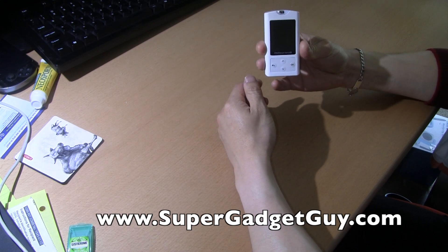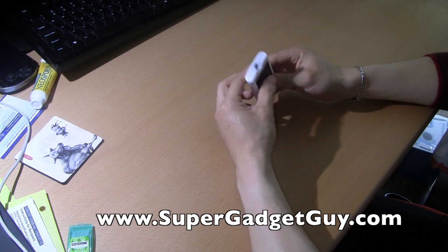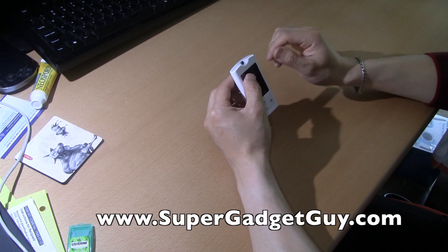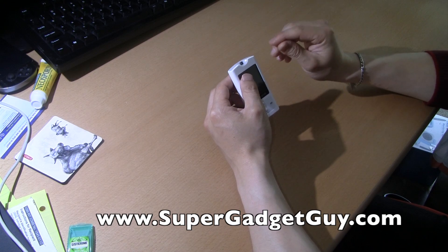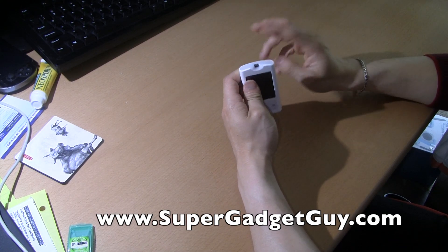The battery life on this is not very good — I have to charge it like once every two weeks. The strips are very, very thin. So if you have arthritis or are very clumsy like me, they're very hard to handle. A lot of times I hold one up, try to stick it in, and it doesn't work — I find out it's actually two strips stuck together.